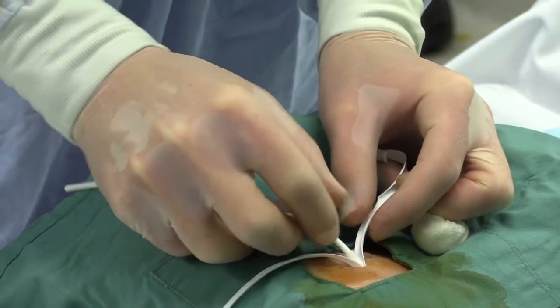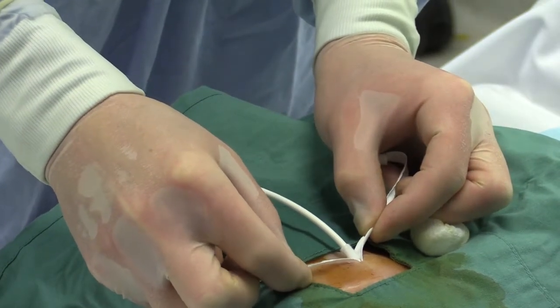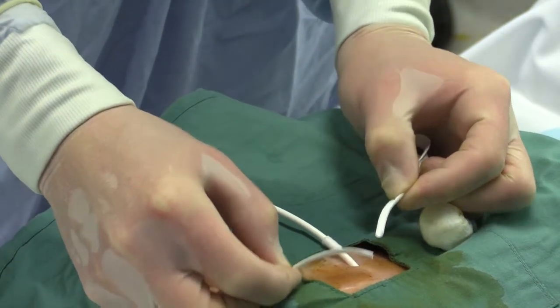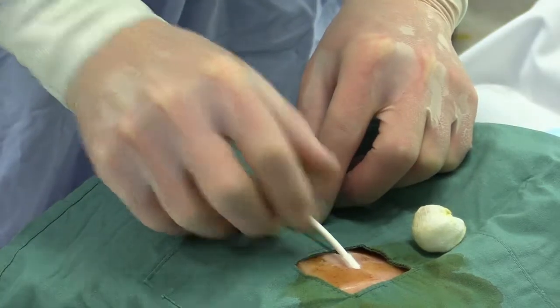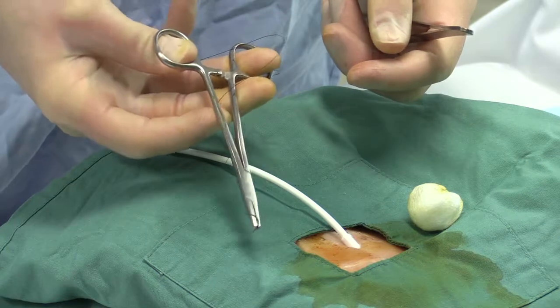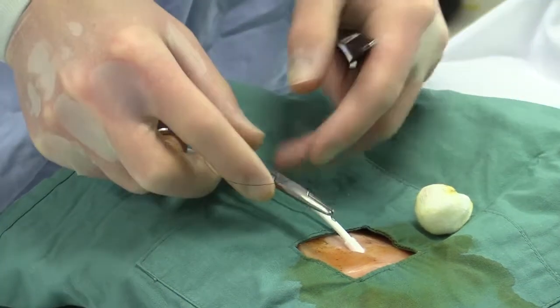Be careful, when the last bit of this catheter splits, it can completely extract both the peel away sheath and the catheter. So guard one's hands when pulling the catheter apart. With that, the catheter is well inserted, the cuff pushed snugly up against the skin, and using a monofilament suture, something inexpensive like a nylon, a deep, broad purse string suture created.